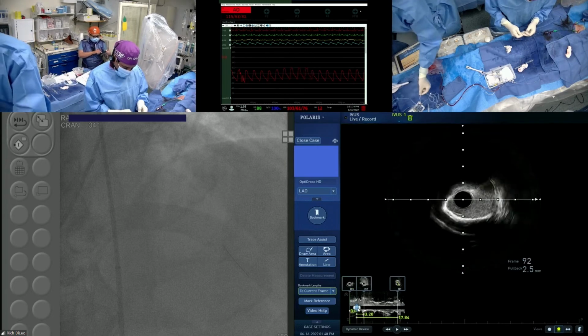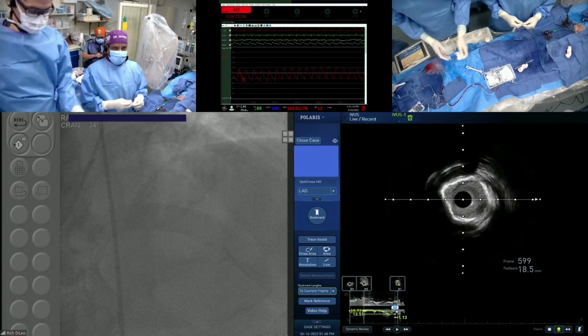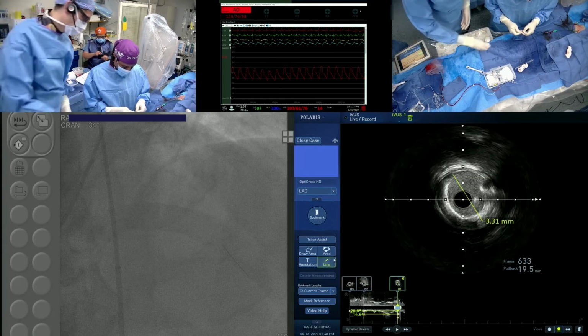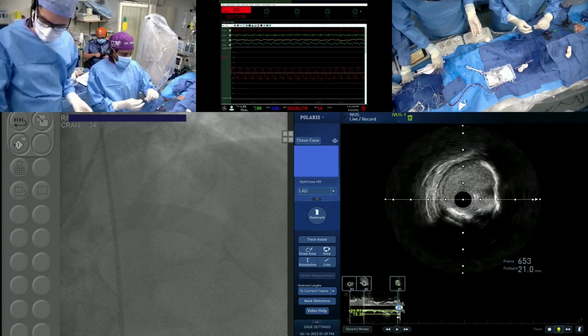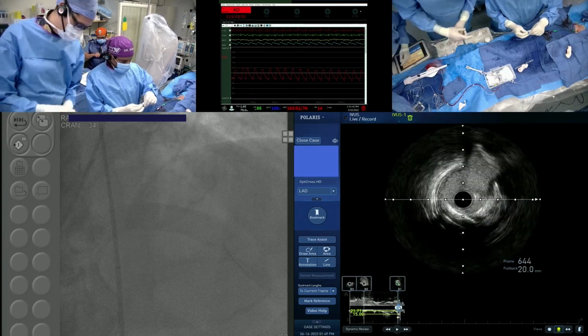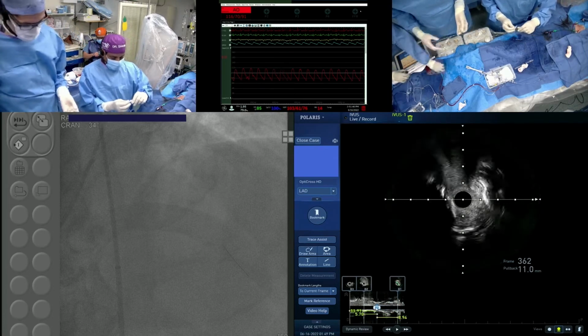Why is this not running? Interesting. Mario, what do you think about robotic or non-robotic LIMA to LAD? I see you anxious in your seat. Hybrid revascularization. RCA has some stents. The patient is on dual antiplatelet therapy. There you go. LIMA to LAD, robotic or not. Doable? What do you think?